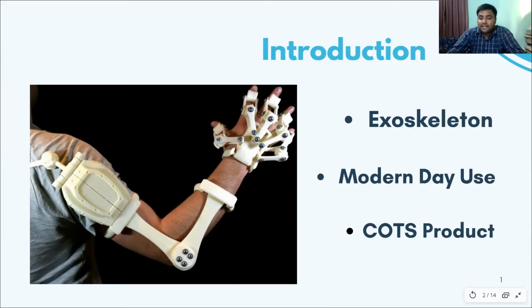There's another thing that we used in our topic, which is COTS products. That means commercially off the shelf products. We build our design using these commercially off the shelf materials, which are not very expensive but reliable.